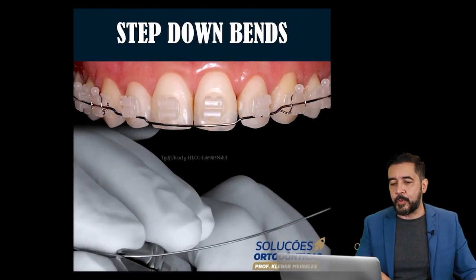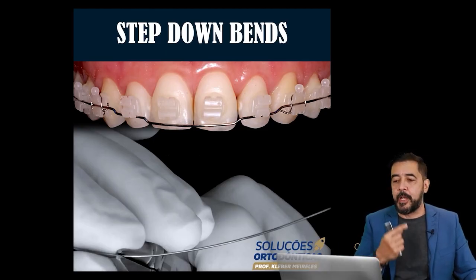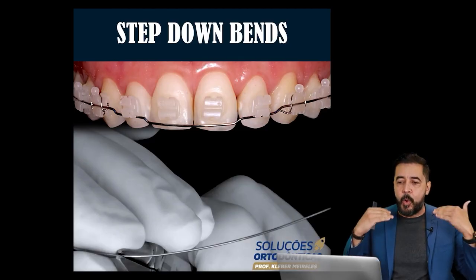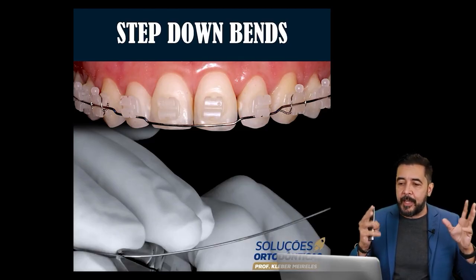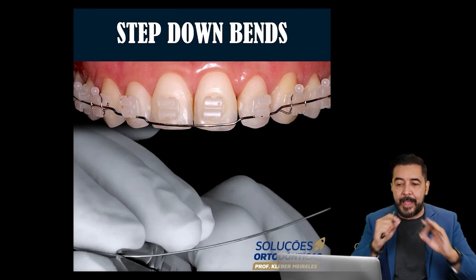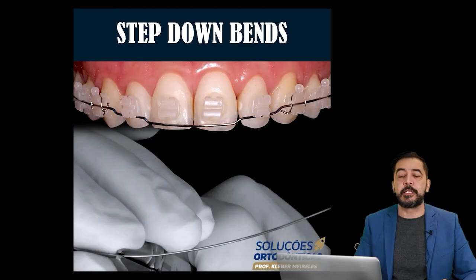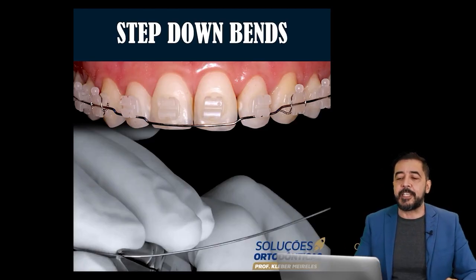So sometimes we can do this in order to achieve a better exposure of the smile arc, and we are going to do this by means of the bonding, or if you already bonded your patient and you didn't manage to do that at the beginning, you can change this doing this kind of bends that we will see thoroughly during our course.